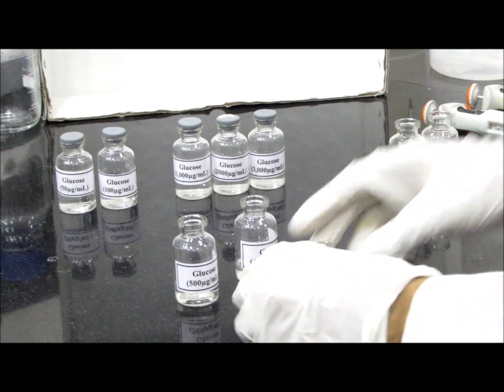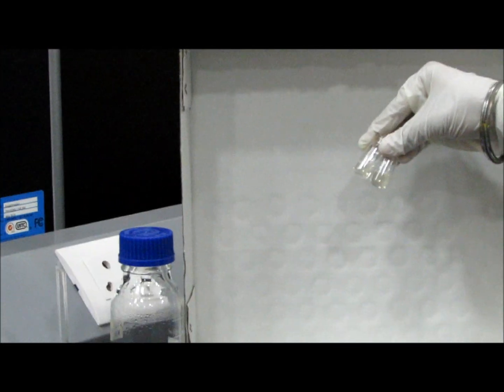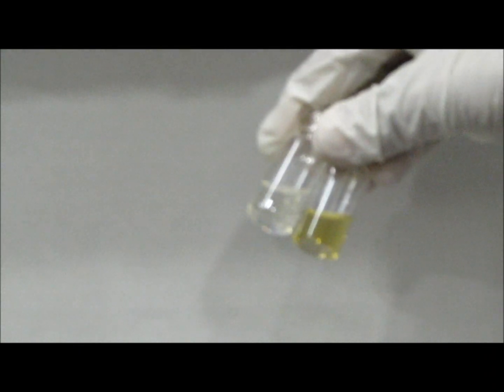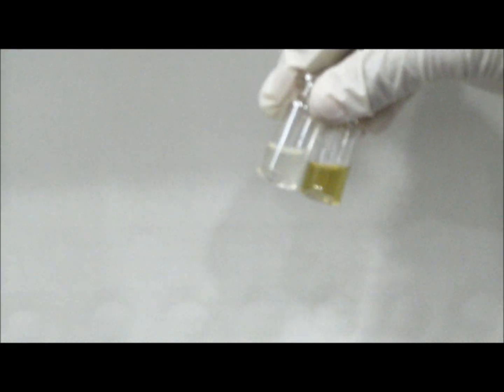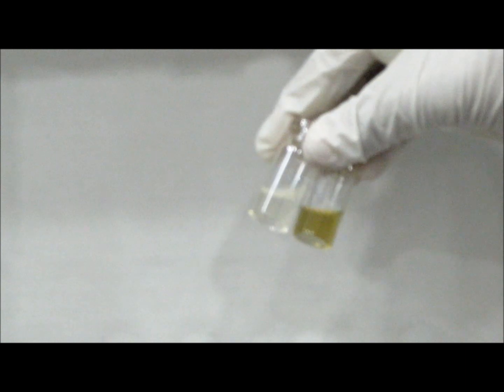Now let us observe the color of these 2 solutions. Observe that the first vial shows less intensity than the other. So from this we can identify whether the patient is diabetic or non-diabetic.